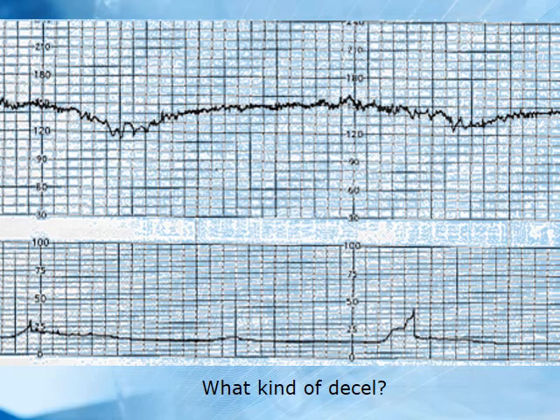These, what kind of deceleration would you declare these to be? It's hard to tell. Yeah, I'm thinking that might be the bit. We need to adjust that TOCO. I can't tell where the contraction is. So we can't really tell.